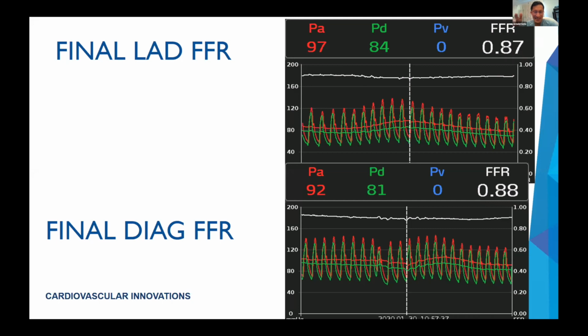This is an assist catheter. Obviously, it's not going to get caught, so you're good. So it's generally discouraged, but so far so good. I haven't had any trapped, and often it won't pull apart. I mean, they say you can actually twist the wire, rotate it out, and maybe another option could be to partially deploy the stent before pulling back.